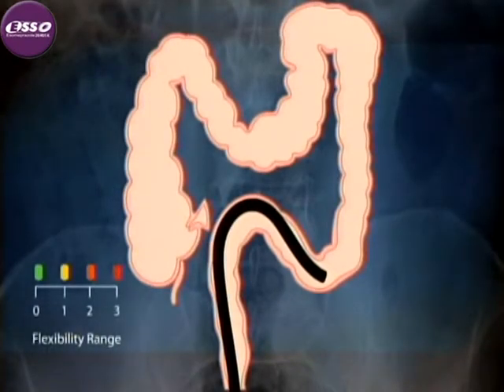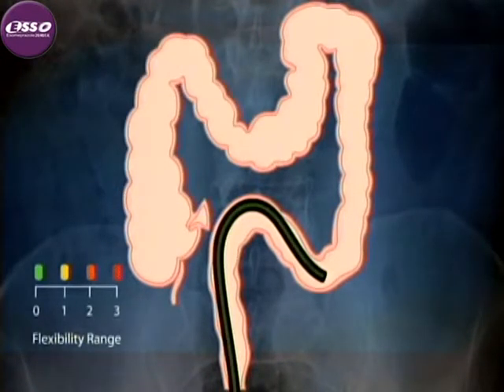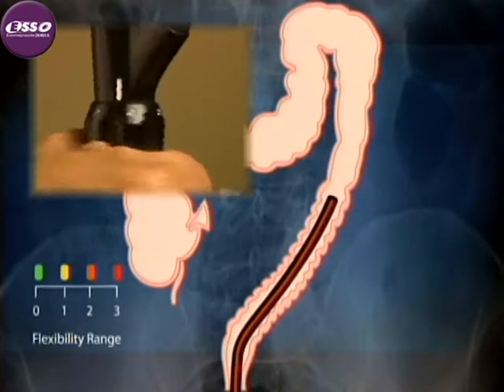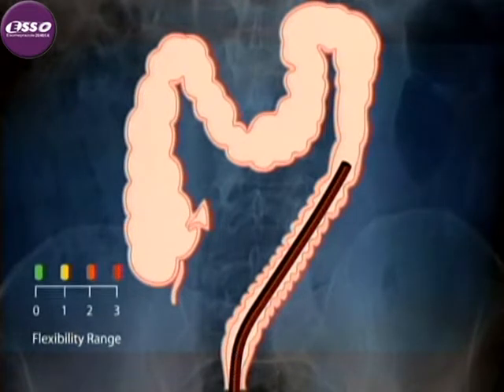Thus, insertion begins with the stiffness device set on 0 or the pediatric colonoscope flexibility range, and the sigmoid colon is negotiated. After the colonoscope tip has been advanced beyond the sigmoid colon, the instrument is straightened and the device is activated so that the stiffening of the insertion tube may reduce the tendency of the colonoscope to form sigmoid loops. Many colonoscopists, myself included, like to have variable stiffness available and feel that in specific instances it seems to help colonoscope tip advancement. Here are some general observations about variable stiffness that may be of value to you.